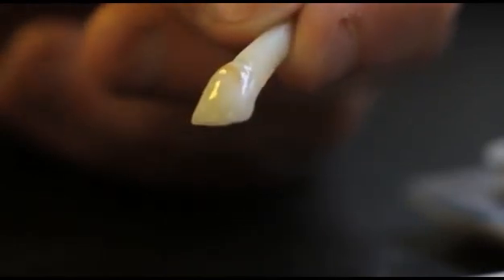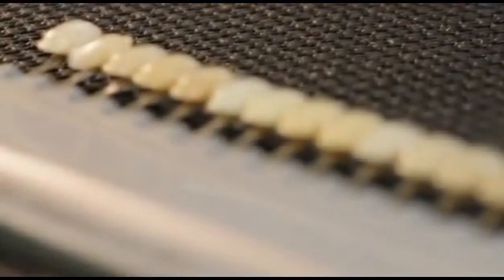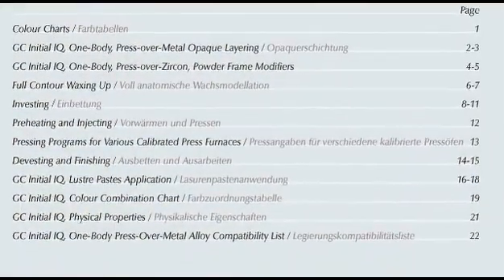Keep in mind: what you paint on is what you get after one firing. To make a perfect Vita shade crown, please follow the basic step-by-step instruction.